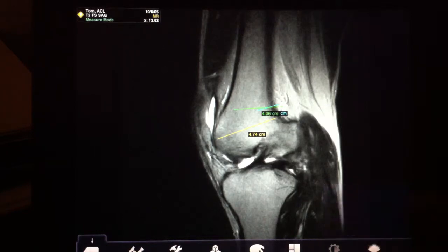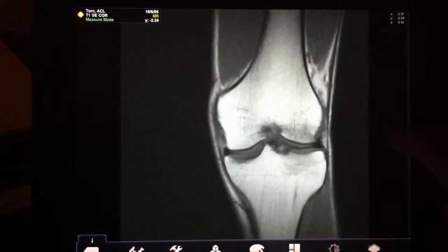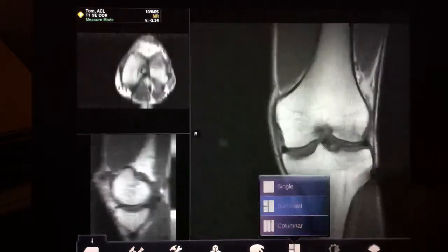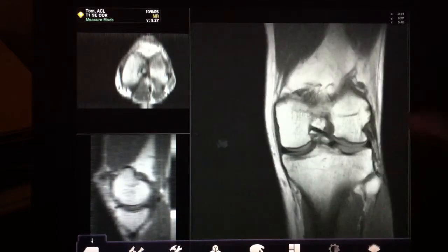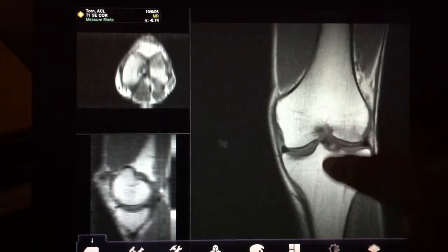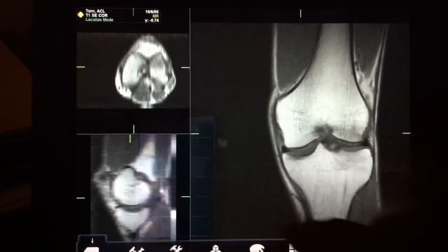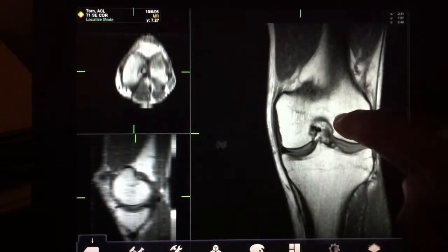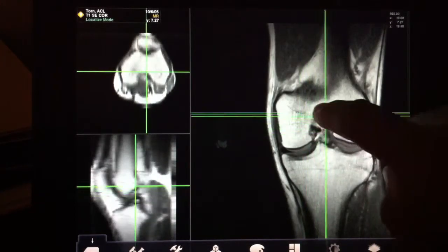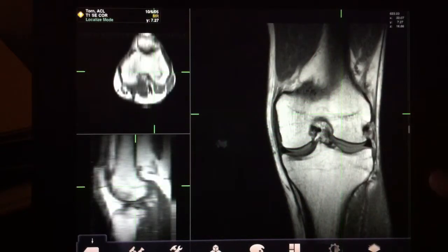As you first saw when we went in, it defaults to actual multi-planar reconstruction, which can be really useful for CT studies so you can see three planes simultaneously. As I navigate through one, initially nothing happens on the other. But by switching to localization mode, which is simply by tapping and holding, you can have all three screens going at the same time, which is pretty remarkable for a small device like this.